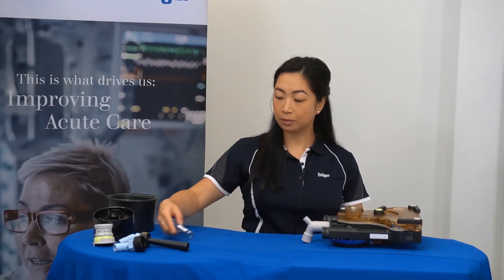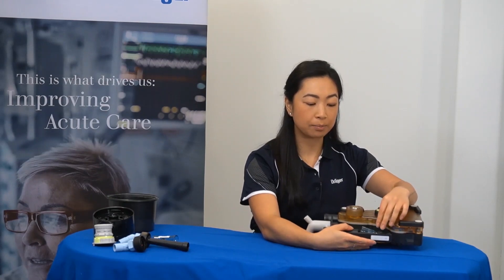Your flow sensors can now be removed. The inspiratory one by sliding out of the port and the expiratory flow sensor by being removed from the middle of the breathing block.